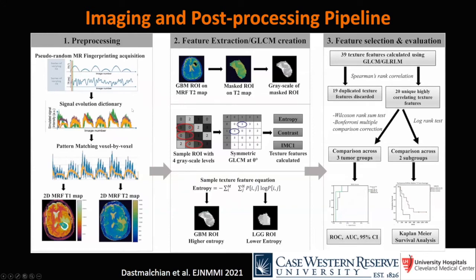Though this slide is very busy, it basically comprises three parts. One is the pre-processing, the so-called pre-processing is the imaging part, which generates multiple quantitative images. The second one is the conventional post-processing, but based on the quantitative maps, which are supposed to be more stable and reproducible.